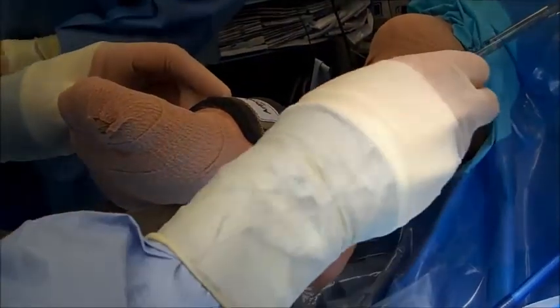We've already made an incision here on the side of the ankle and we're going to be passing the scope in shortly. We're actually in the joint right now. You can see one of my instruments — this is actually a shaver that's going to eat up some of that bad scar tissue in the joint.